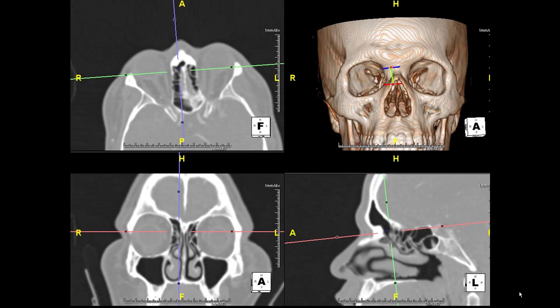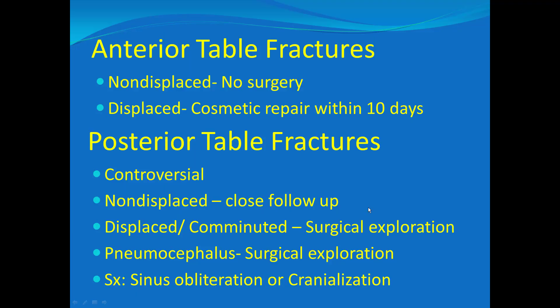Here are some MPRs and 3D reconstructions showing the location of the naso-frontal duct, which goes into the hiatus semilunaris. If the anterior table of the frontal sinus is fractured and not displaced, surgery is typically not needed. If it is displaced, they may choose surgery for cosmetic repair. If the posterior table is fractured, it's a bit controversial, but these will frequently be surgically repaired. If non-displaced, close follow-up may be chosen. If there are signs of violation extending into the cranial vault, neurosurgery may be required.